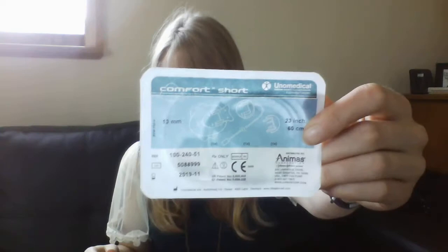I also have a site. So I've chosen to just put the Comfort Short in there because the Comfort Short is the flattest site that I have, and it doesn't come with an applicator, which makes it flat. But also, if something was to squash that, it's not going to break the needle. So I did have a contact detach in there at one point, but it got squashed and the needle then bent, and I wasn't comfortable with putting that into me. Whereas with this, that will not happen.